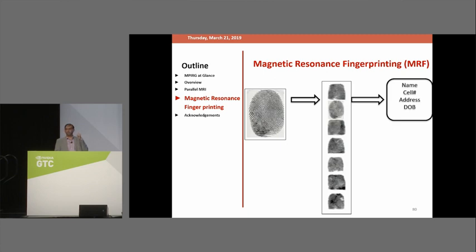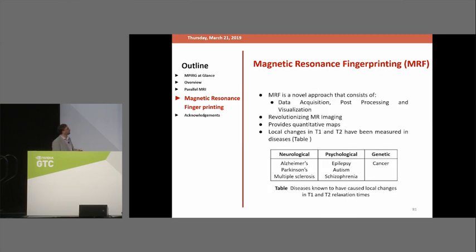So when you apply the RF pulse, the signal is absorbed by the tissue, and then it comes out. As soon as the signal comes out, it will be matched to a whole dictionary of signals, which has been made by using Bloch equations. And then, by the match, it will find out which is the best match, and that will give us the signal. So that is actually revolutionary because obviously it will be the absolute value of the signal, which you'll be obtaining from the already pre-calculated mathematical models, and very little effect of noise as well.